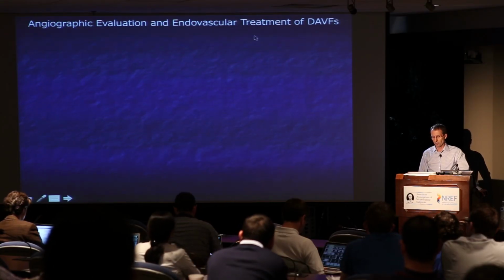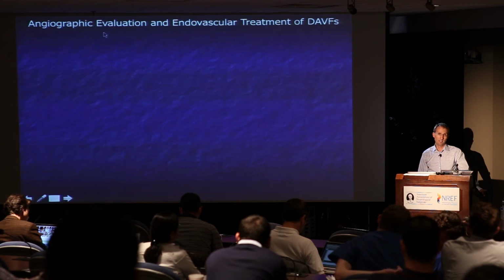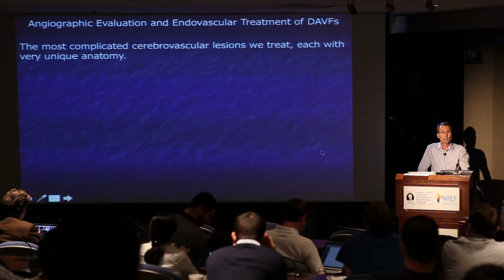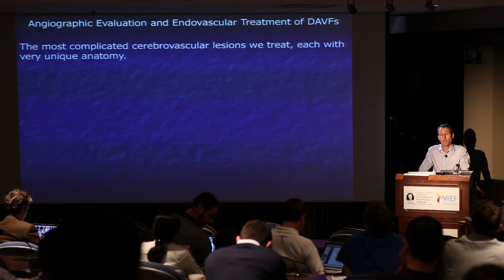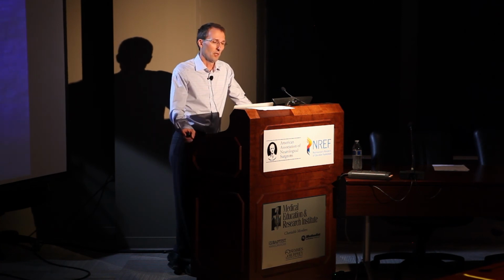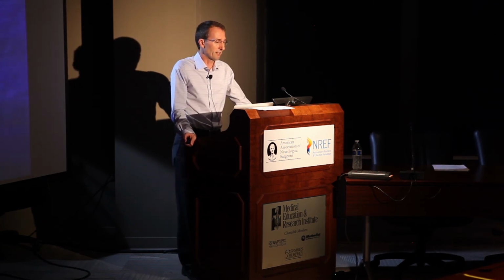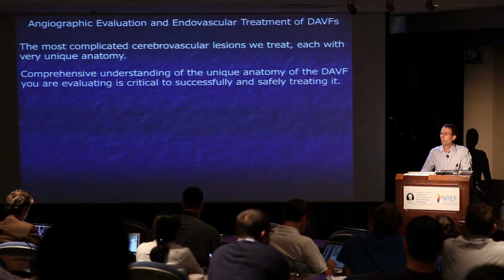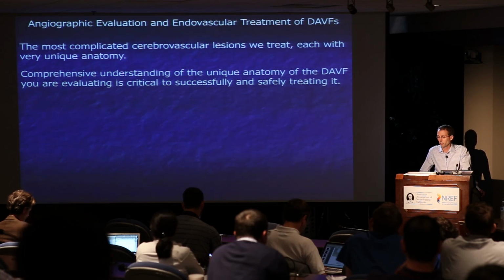When I was asked to talk about angiographic evaluation and then the techniques of treating dural fistulas, I decided that I wanted to focus a lot on the evaluation itself, because I think we should realize that dural fistulas are probably the most complicated cerebrovascular lesions that we're going to treat. Everyone is profoundly different and individualized in my experience. We treat a lot of ACOM aneurysms, and yes, they're very different, but they all have underlying general themes. Dural fistulas are very different, and a comprehensive understanding of the anatomy of the fistula of your particular patient is what's going to be critical to successfully treating it, and most importantly, to treat it safely.